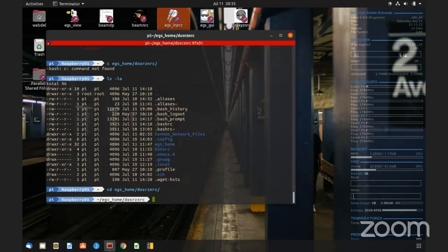I ran it on Raspberry Pi 4, on a Raspberry Pi 3, and on my virtual machine on my Mac. I did not run it on a computer at the hospital, but maybe I can do that. So here are the results. I made the number of histories 1 million.